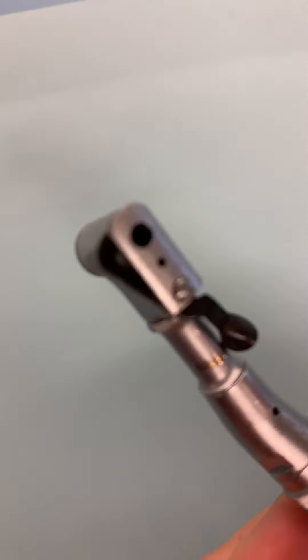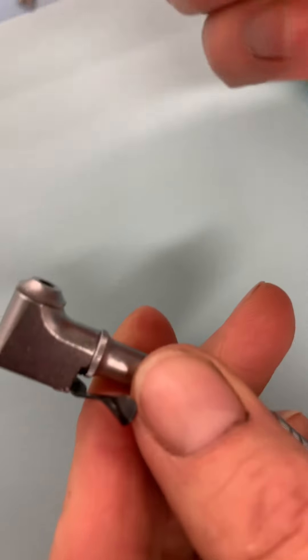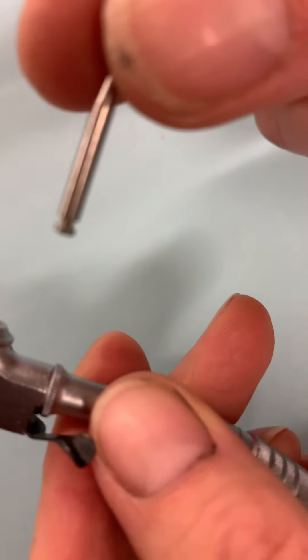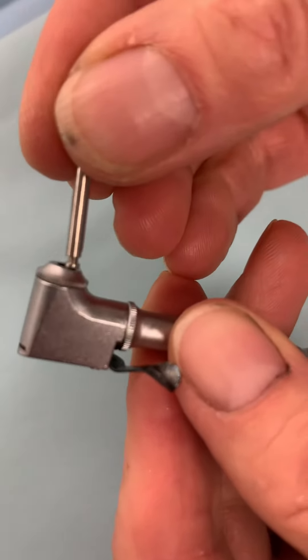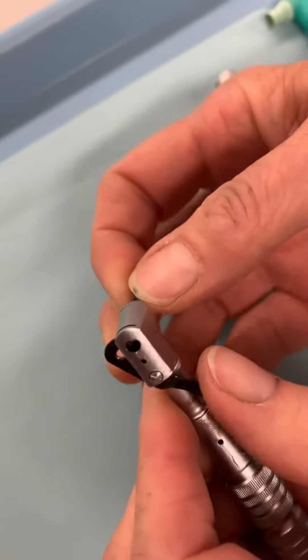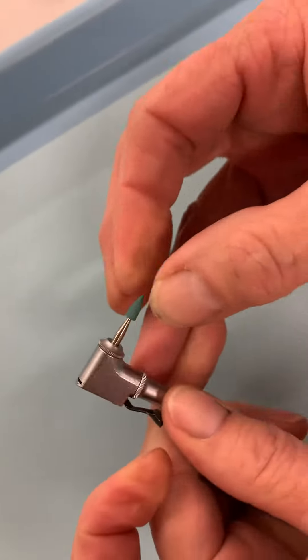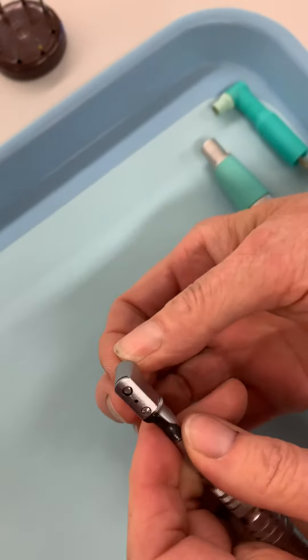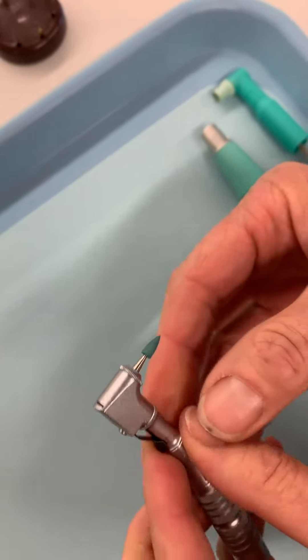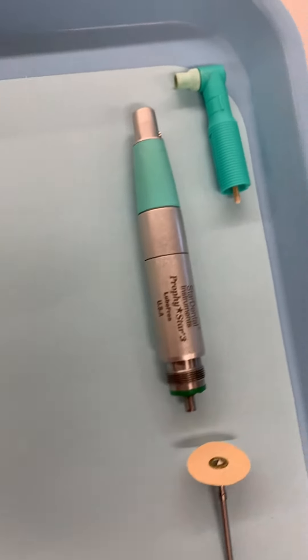We'll look at how we load things in there. Your slow speed is always going to use a latch-type burr. If you look, this burr has a latch on the back that's going to slide into the end, and then you latch it — always check it to make sure it's in good. So slow speed uses latch burrs.